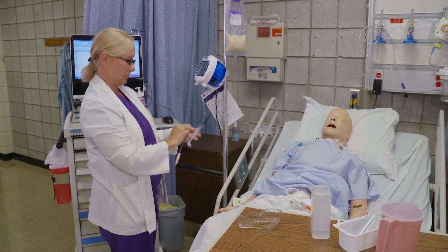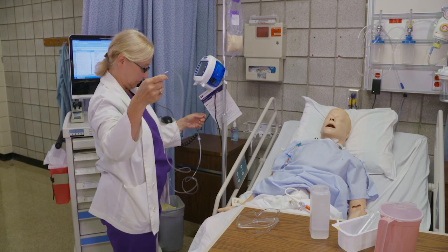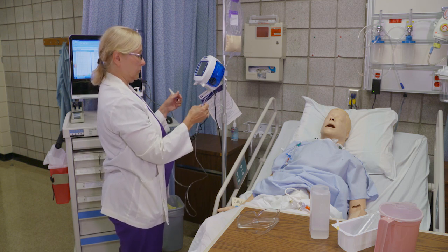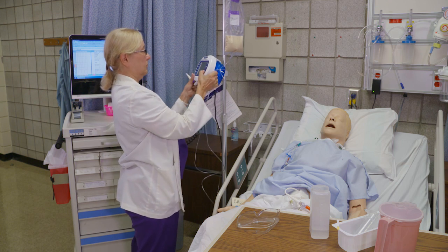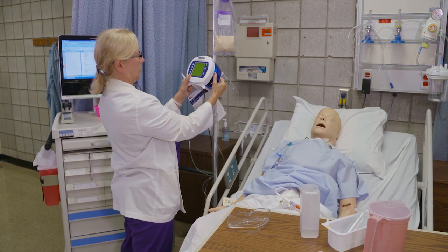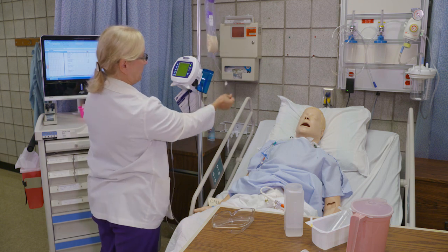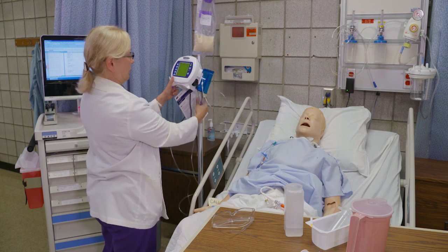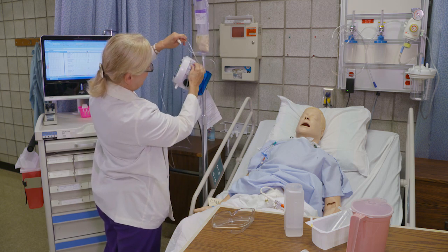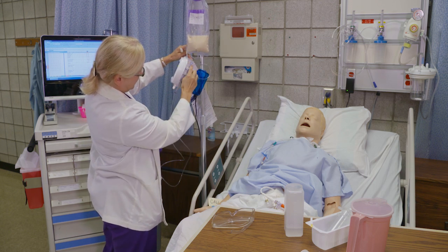Make sure that the pump is plugged into the wall and follow directions on the screen. You may refer to the video regarding pump usage. Press the power button on the control panel in the lower right-hand corner. Press Clear Settings to clear any older settings. Open the blue door, enclosing the feeding set loading area. Load feeding set. Place the round valve on the tubing. Insert into the left side pocket.